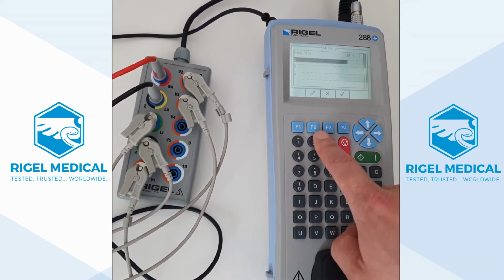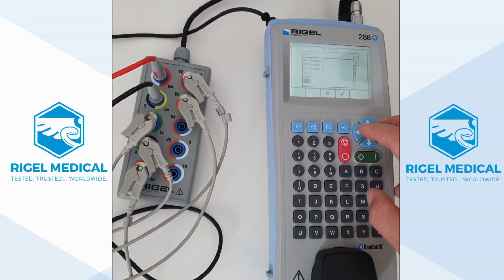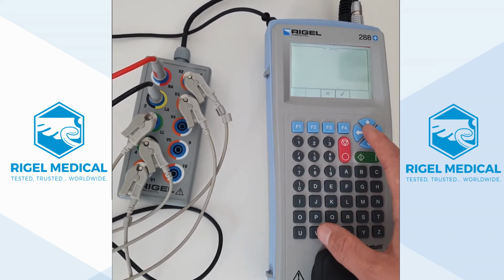And then we'll edit our second, which we'll call ECG. Type of classification, which is CF. Number of patient connections, we've got 5. So there we go, it's automatically set up.